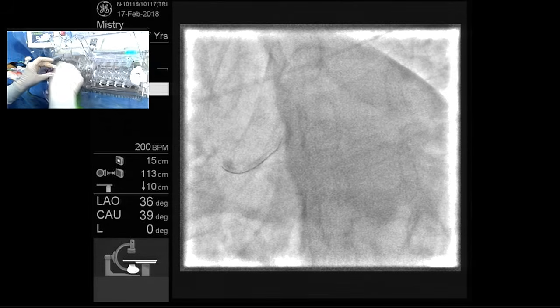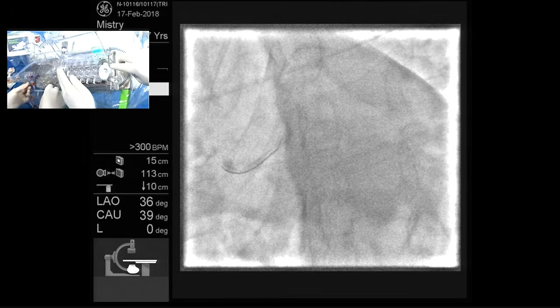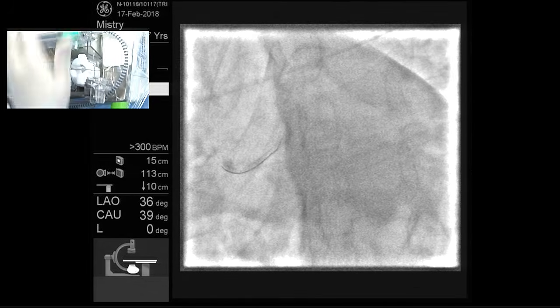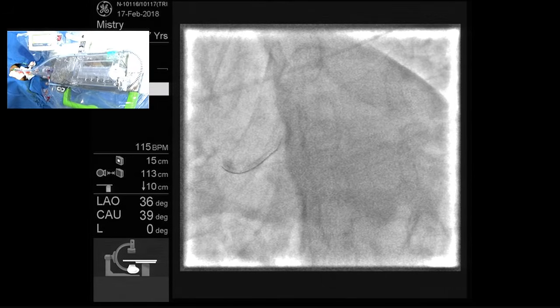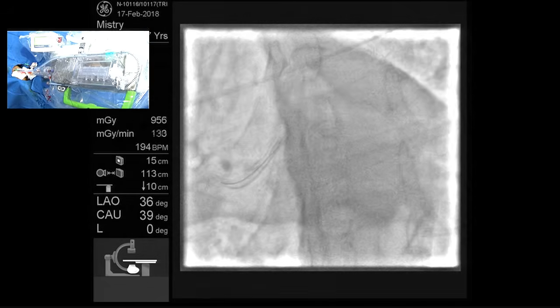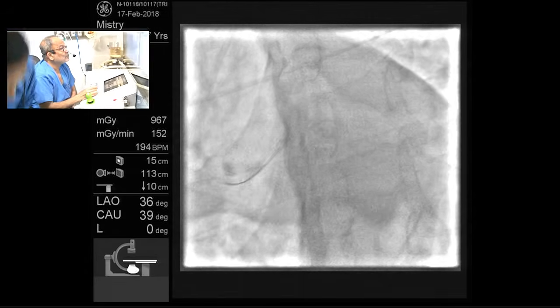As of now, this technology is only for the coronary space. We have done renal stenting, that is an off-label indication. We have done renal iliac, you can do it, no problem. I think that's where the advantage would be a lot, particularly for the lower extremity endovascular procedures. Those are generally speaking long.